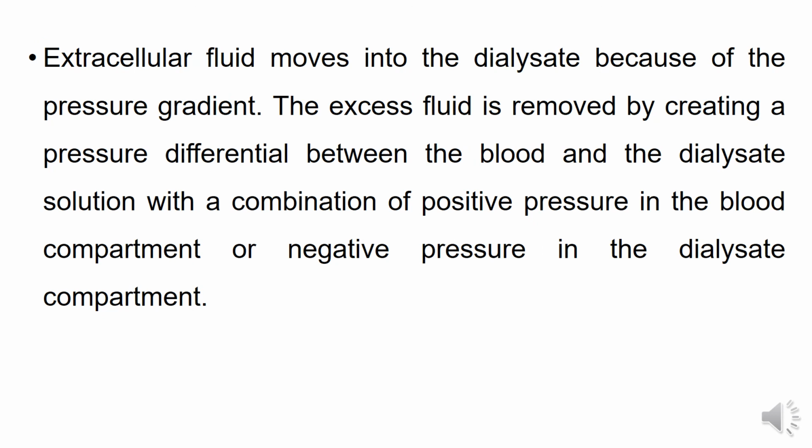Here the extracellular fluid moves into the dialysate because of the pressure gradient. As we already discussed, there is a pressure difference, so the extracellular fluid moves according to the pressure. This is the main principle.